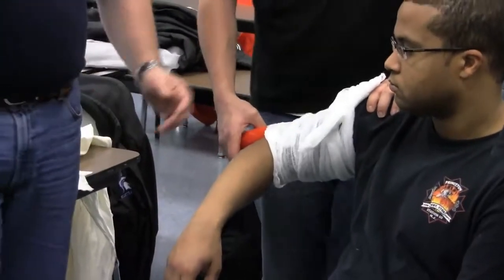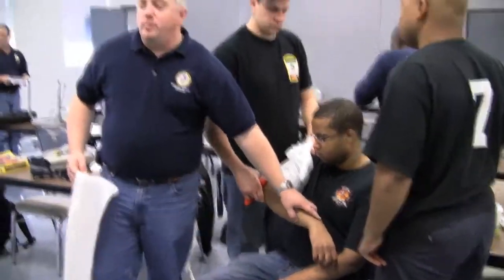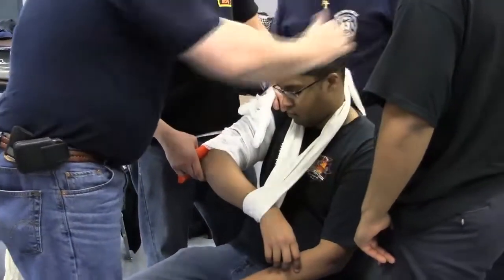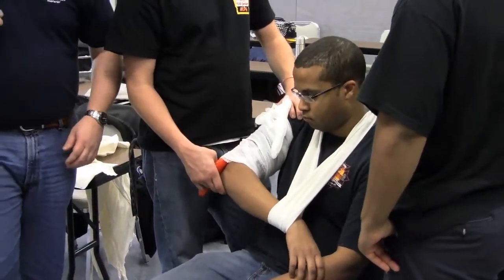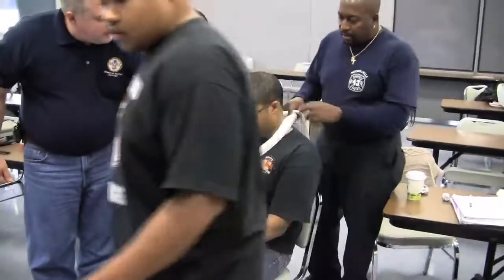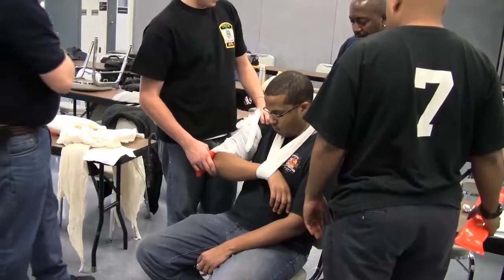Now we need a sling and a swat. Same position again. With this one, we've got to remember, we don't have any injury here. What we want to do is just support that. So we're just going to do a sling — put it right there. Just a narrow sling to support the wrist. You want to support it up to where it is. Pull that up and use it, right about there. It's basically straight across the chest.